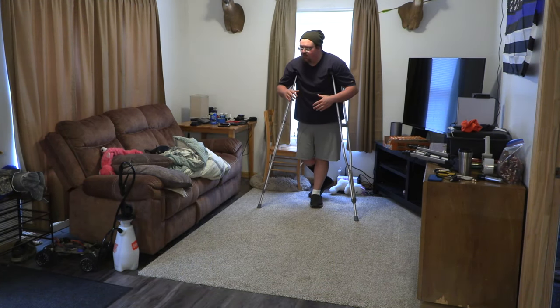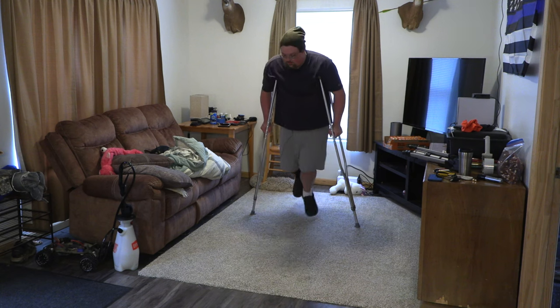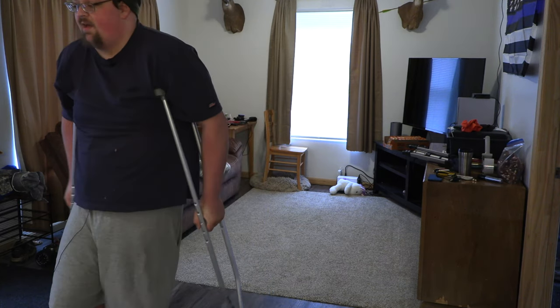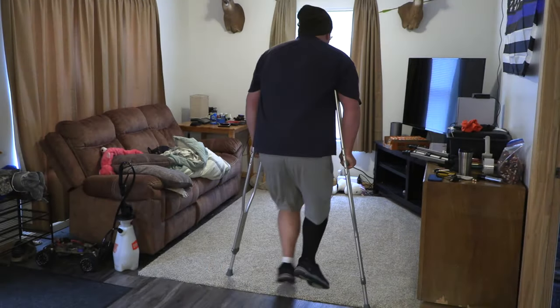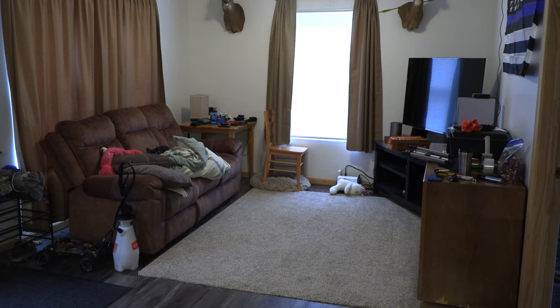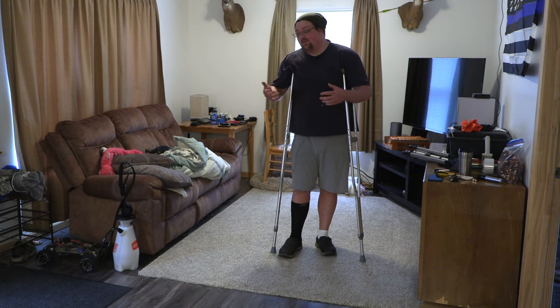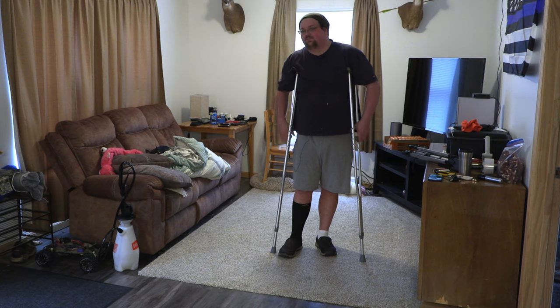Now if we take what I just did and chain it into a walking motion, it'll look like this: weight on the crutches, gravity forward — weight on the crutches, gravity forward. This is a little more fluid than what I just demonstrated, and this is generally how you see people using crutches — it's generally super fluid. A lot of people are even more fluid than that. I'm just a heavier guy, and the extra weight makes it a little difficult and amplifies every little imbalance.